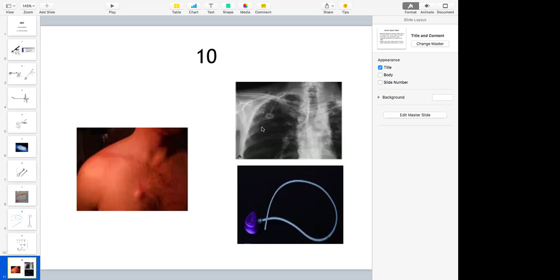These things are asked in DNB exit exam, where you are expected to know a little more than the MBBS students. Now, chemoport is placed in all cancer patients, wherever you need to have a venous access for a longer duration. But there are some patients in which you must put a chemoport. So give one indication where you must put a chemoport.